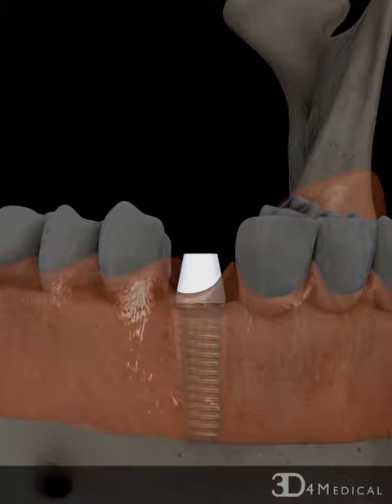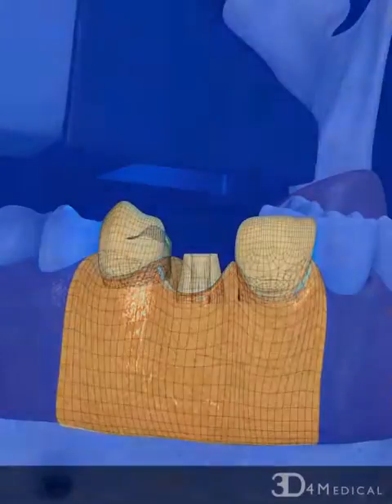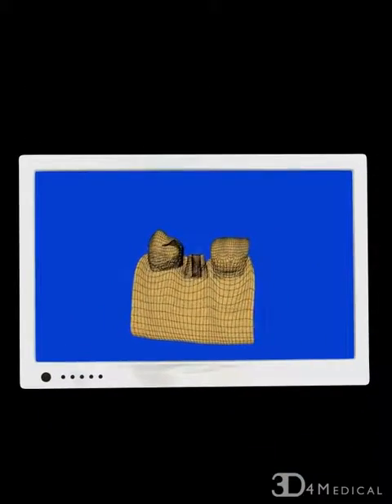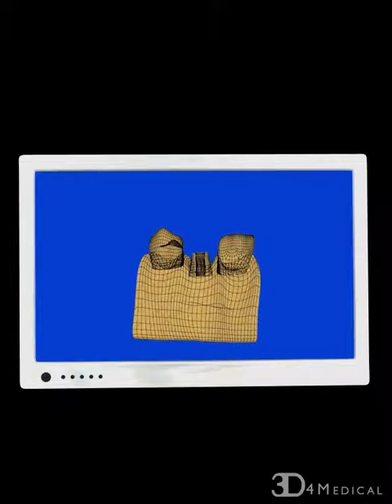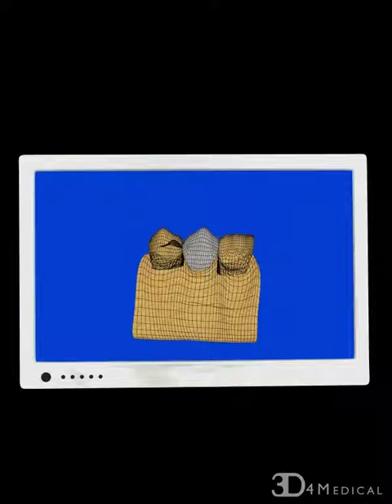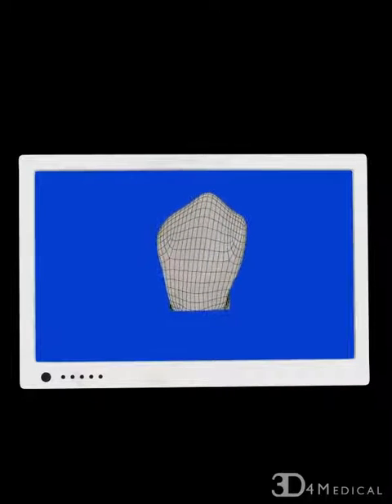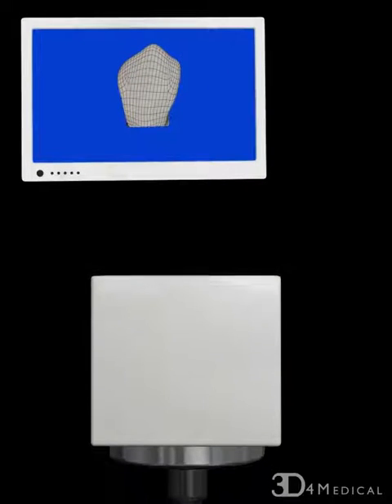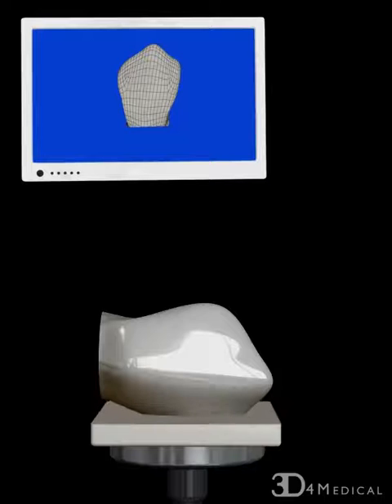A laser wand is then used to scan the gum so that a 3D model of the abutment and adjacent teeth can be created. The dentist then uses computer-aided design software to model a custom crown. The crown is then automatically milled from a tooth-colored material using computer-aided manufacturing technology.